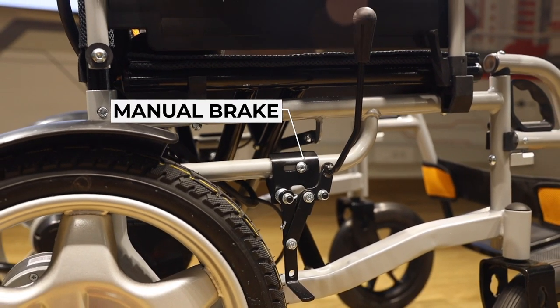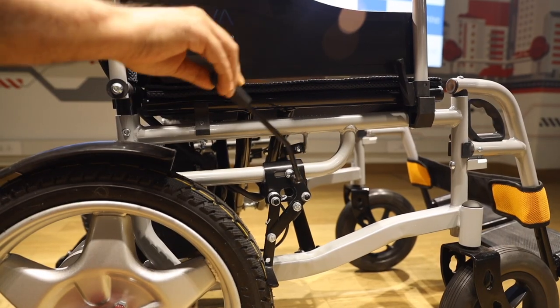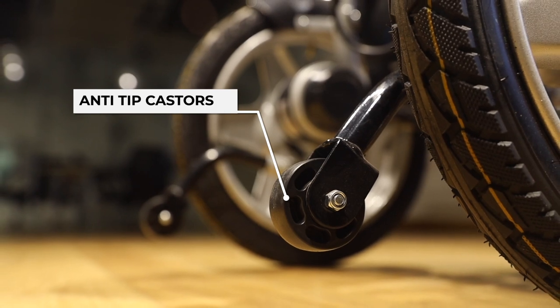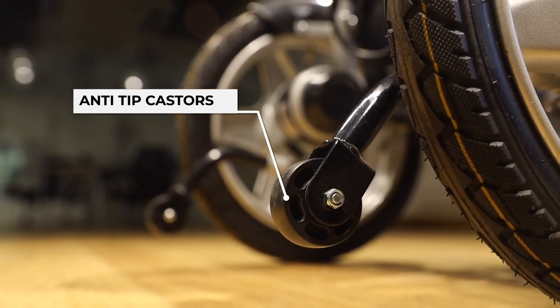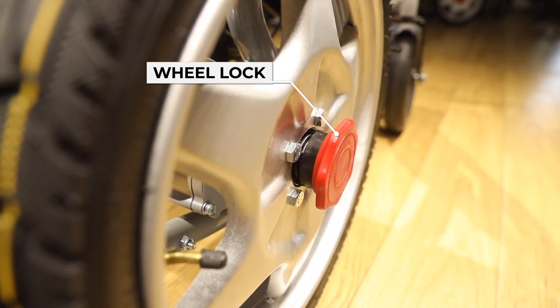Manual brakes with an anti-skid braking system. Anti-tip casters are provided for additional safety. They come with a wheel lock for total protection.